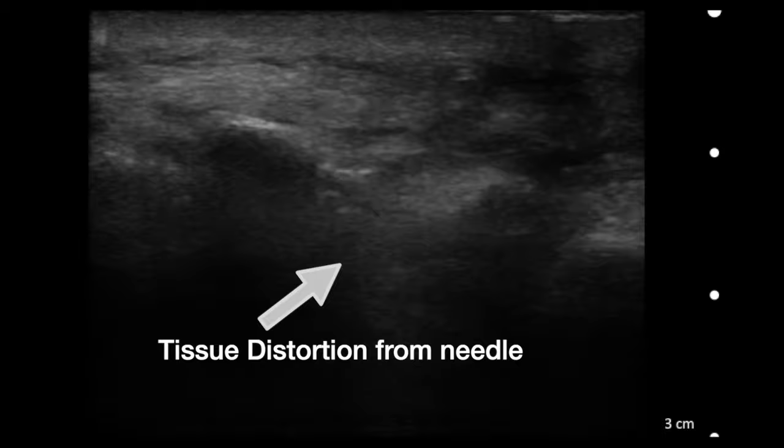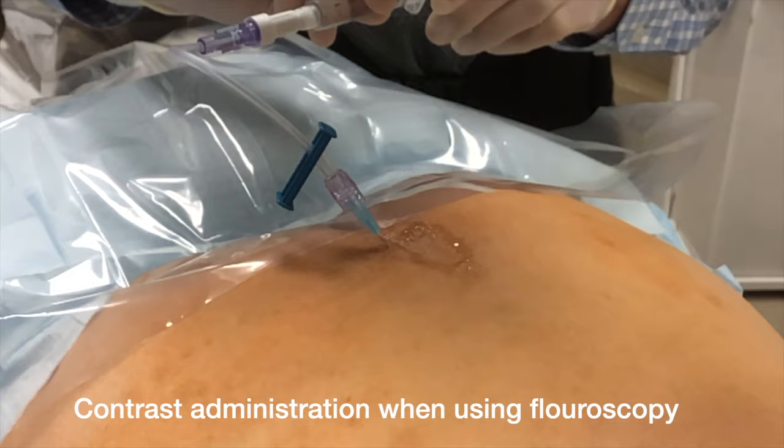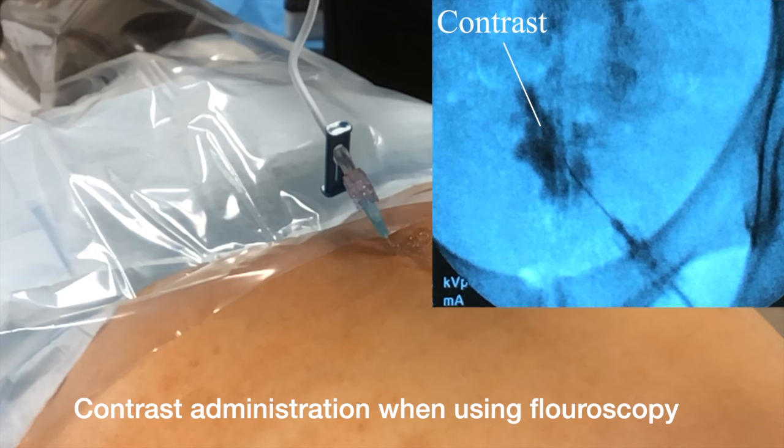Here you see an out-of-plane approach with tissue distortion from the needle tip. In this case, contrast is used to confirm with fluoroscopy. The injectate spreads slightly laterally, but the center of the image is anesthetized with the injectate.